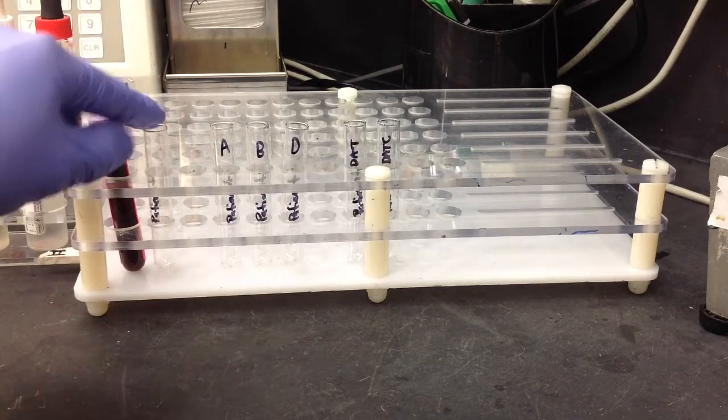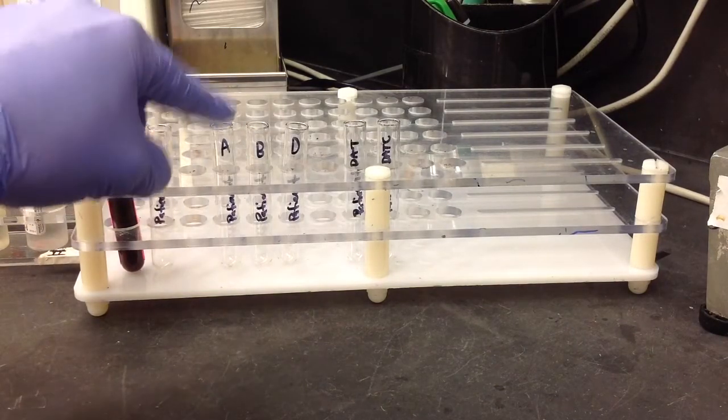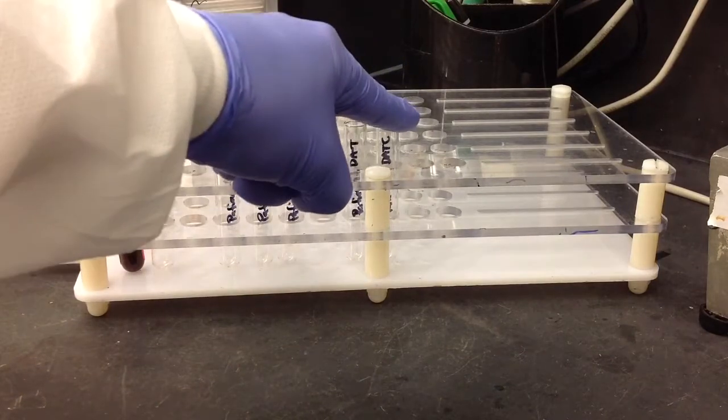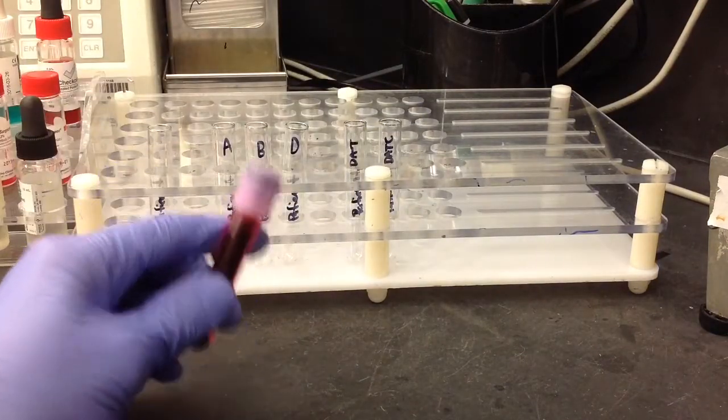And the first thing you're going to go ahead and do is label all your tubes. So I'm going to use that tube for the suspension, and then your AB and D antiserums and your DAT and a DAT control tube.